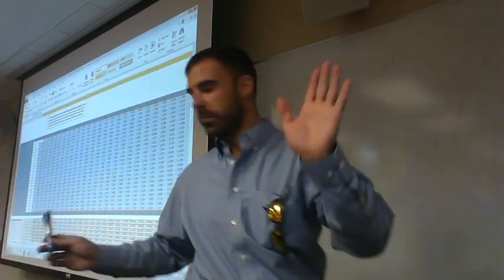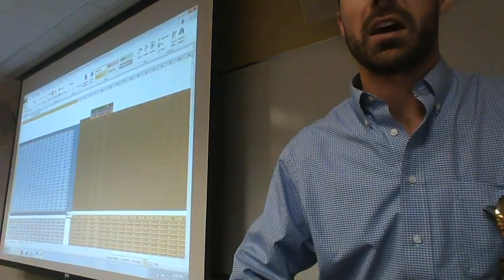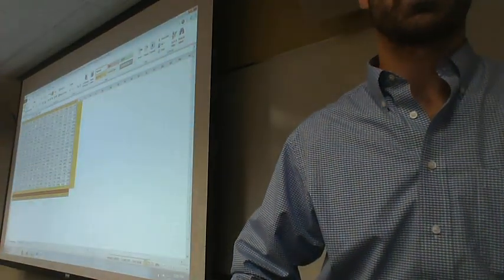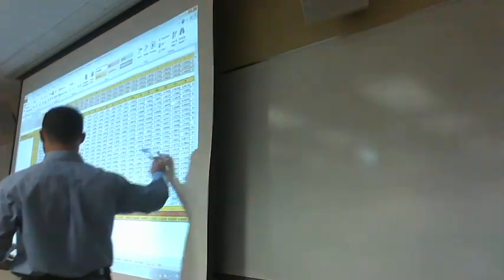What they are doesn't matter for the purposes here because they're not the part that matters to us. We see that everything else became numeric as well. We've got the minimum of the average, the maximum of the average, and of course the subtraction of the maximum and the minimum. These are some important values for the calculation sheet. But like I said, all that matters for using this is this highlighted yellow table. These are the range normalized values now. And you'll note that you can verify that because the minimum of all our scalp average is 0, and the maximum has become 1. So what it shows is that we've actually normalized the range.